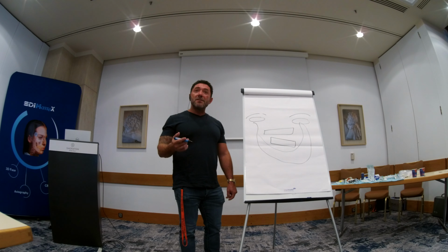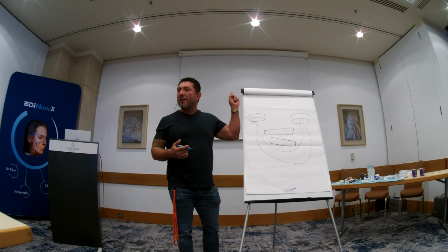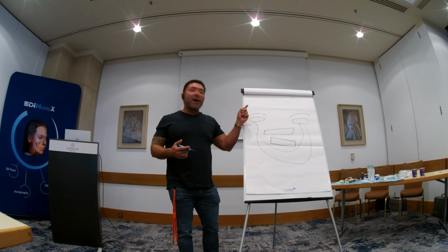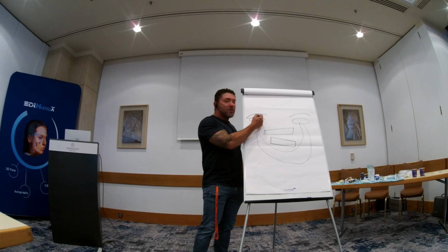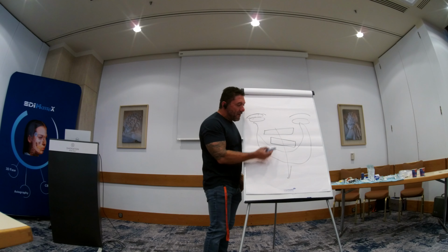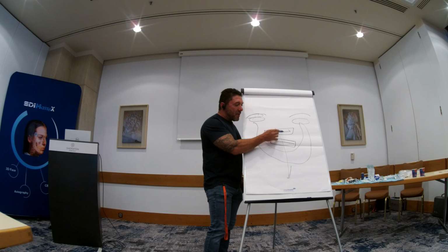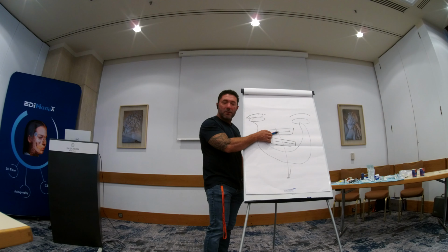And you're going to experience that when your doctors buy the system and send you the data back, you're going to be able to identify things like that. And you need to be capable of telling that doctor that that case is not a two-appointment case. That will require time to treat these components over here until the trajectory starts getting clean. And that is independent of the relation between these two elements, the upper and the lower, because the relation between the garage and the car is normal, or is abnormal.